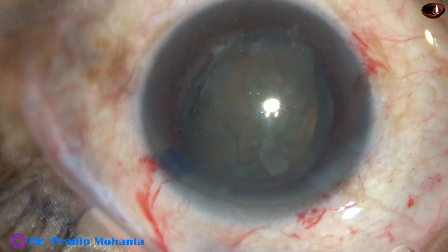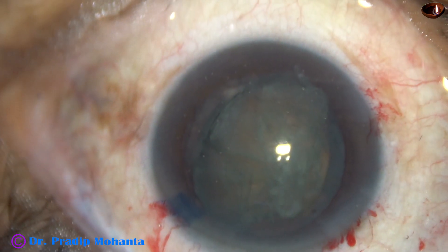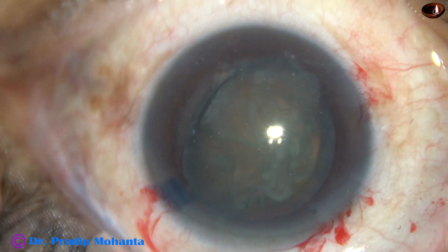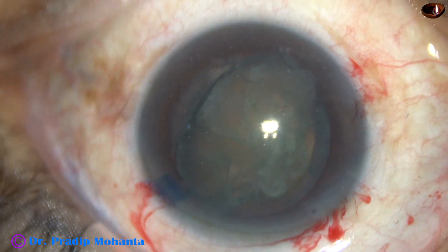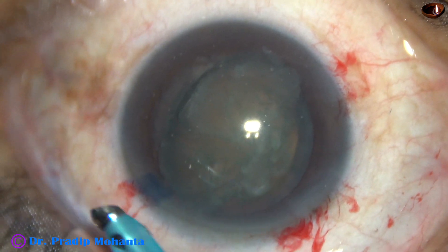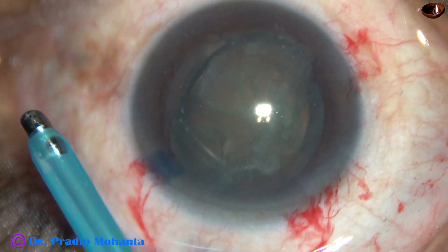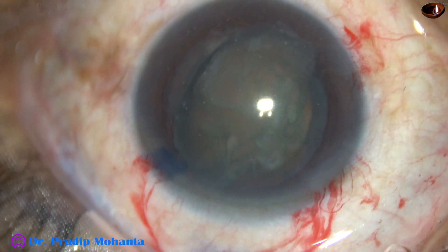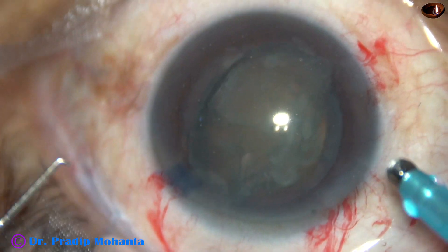Now, visco is injected. And no attempt is made to push the nucleus back into the capsular bag. This lens is just like an idli, which is a famous South Indian breakfast. And we just have to eat this idli in this position.